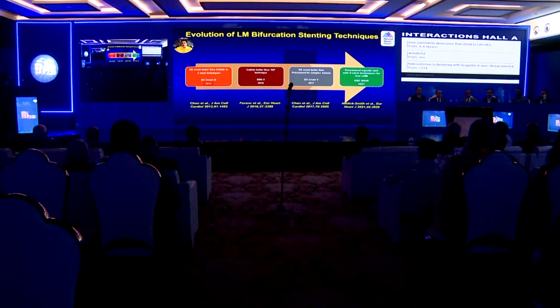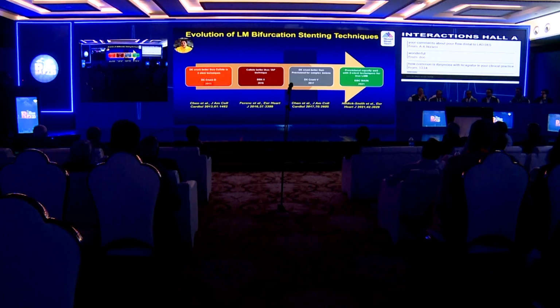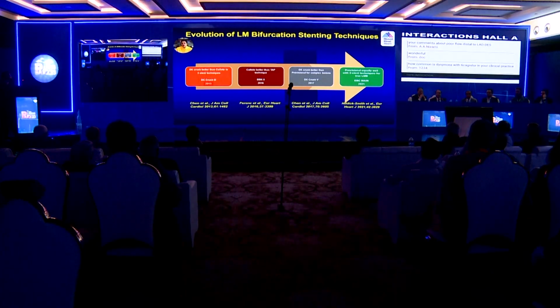Then Culotte was better than the TAP technique in BBK2 in 2016. DK Crush was better than provisional stenting in complex lesions in the DK Crush 5, which I'll be discussing a little bit later. And then provisional, which is equal to two-stent technique, was shown in EBC main. So DK Crush is mostly done in China, the others are done in Europe.